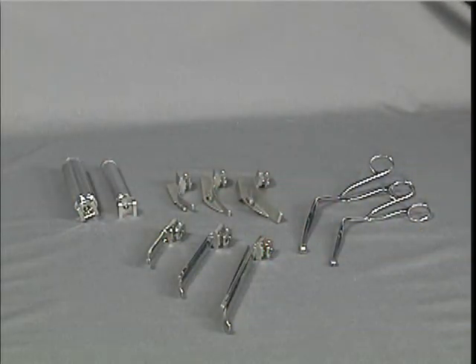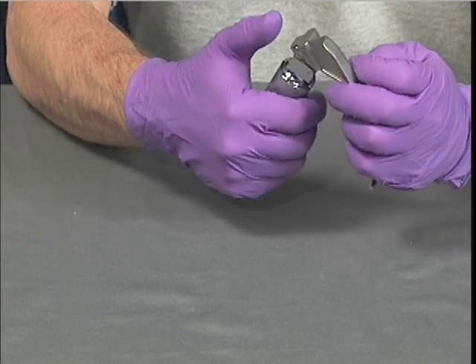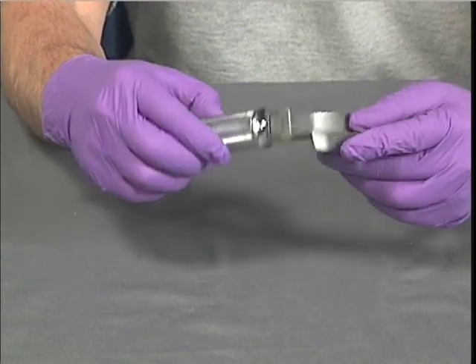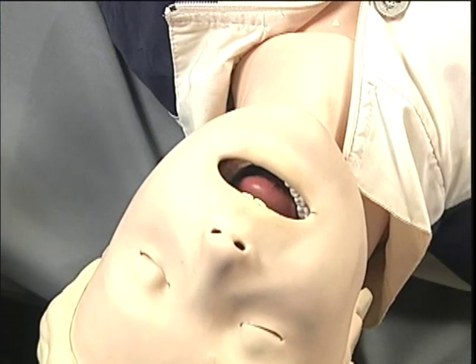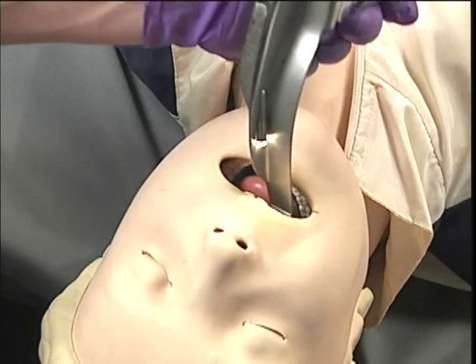The steps for this skill include choosing the appropriate sized equipment based on the patient's size. Assemble the blade and the handle, and ensure that the light is bright and tightly secured in the blade. Position the patient's head in the sniffing position and hold onto the laryngoscope in the left hand.